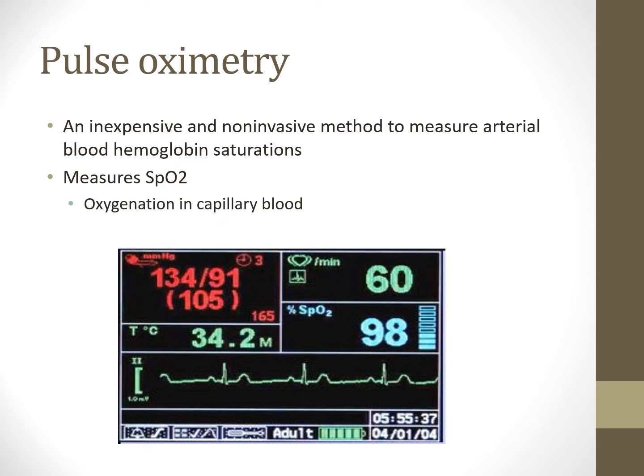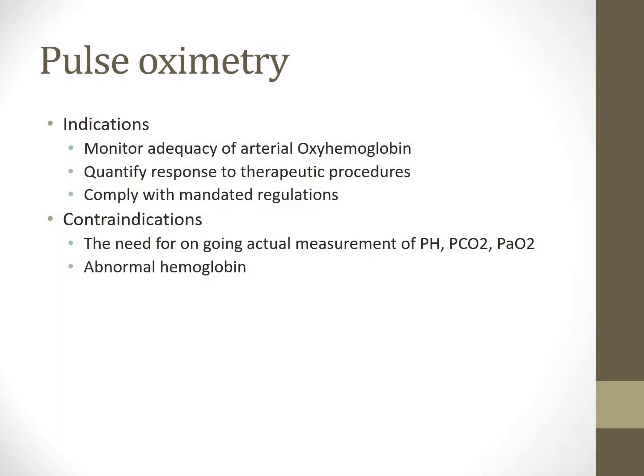So we're looking at SpO2, so pulse oximetry. So we're looking at how much oxygen in theory, so we're assuming, right? So pulse ox assumes that whatever's on the hemoglobin is oxygen. And so that's what we're looking at here. So how much of the hemoglobin is being taken up by something it's assuming is oxygen. It does this by photospectrometry. So we'll talk about this a little bit more.